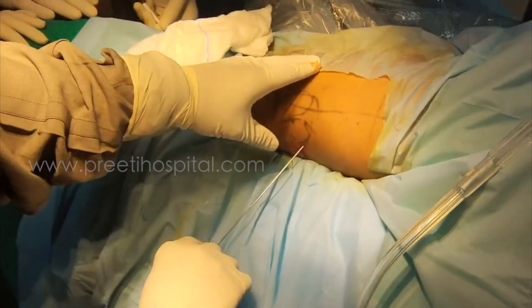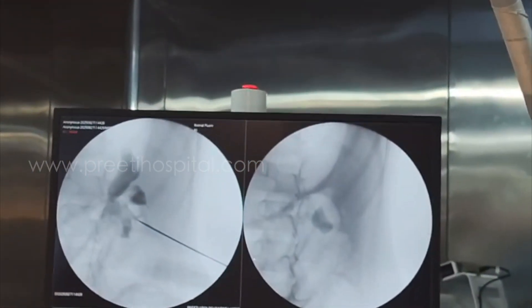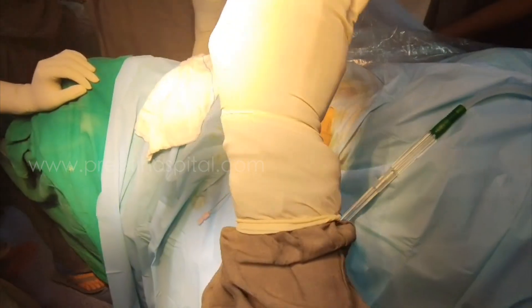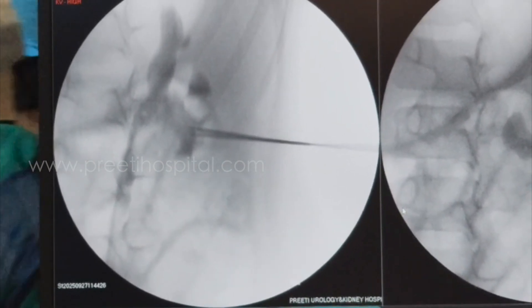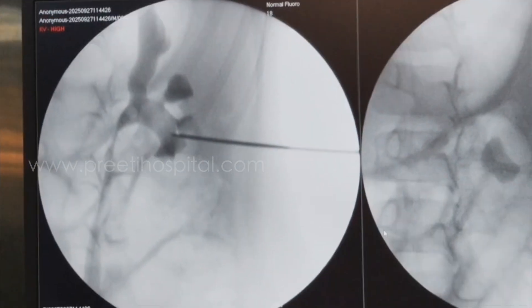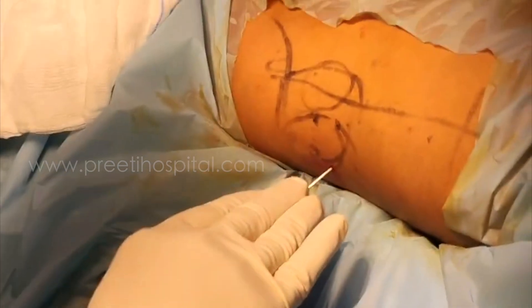There will be this much movement in the kidney, so I wanted to move it and show. I can see it is moving. Now I applied pressure and held it. What I am thinking: 30 degrees above, then 5 degrees more. If it is already separating, next 5 degrees. It is slightly coming down. Now inject contrast — that means what I wanted to puncture has come down a little after turning the full 30 degrees.